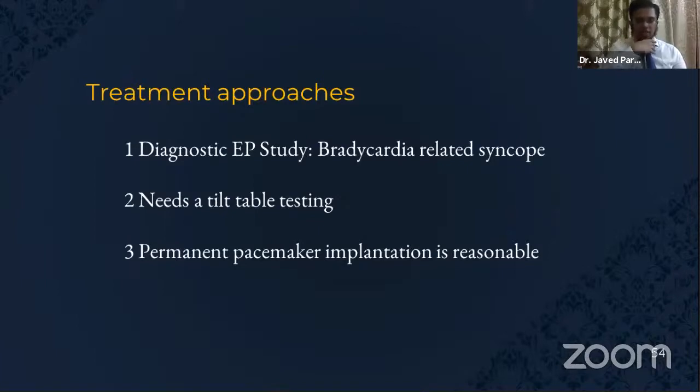This looks like a sinus bradycardia, and this syncope is because of sinus bradycardia related syncope, or there may be sinus arrest, we don't know. Or this is an atypical vasovagal syncope. We need to do a tilt table test to prove whether this is vasovagal or not. Or we can straight away go and do a permanent pacemaker, what we believe that pacemaker will solve this problem.